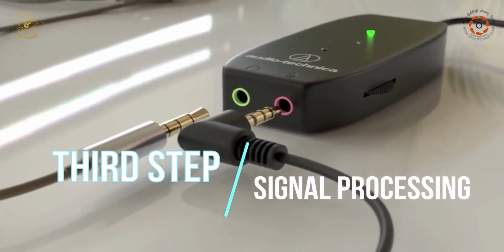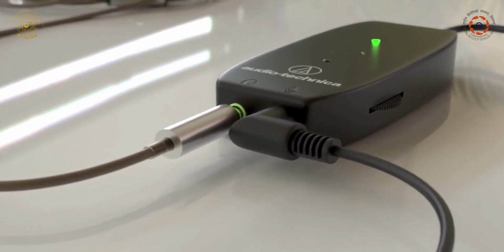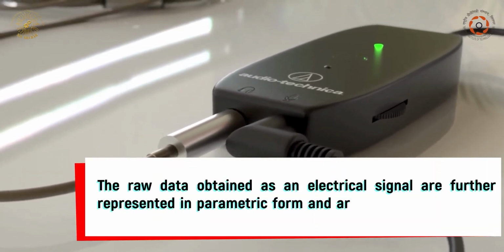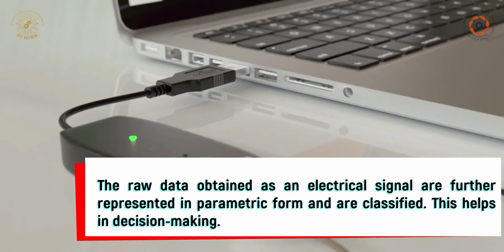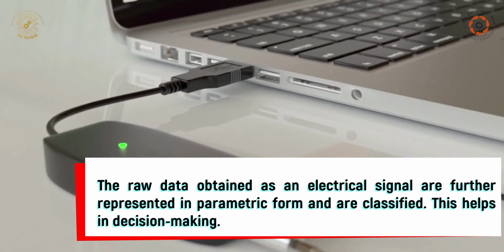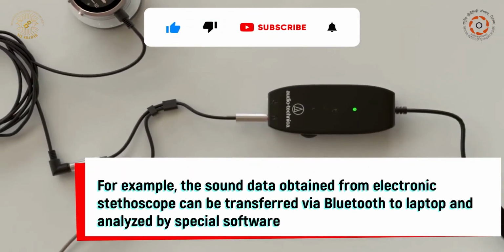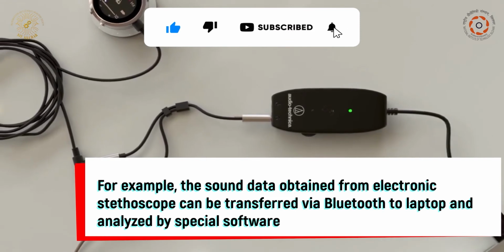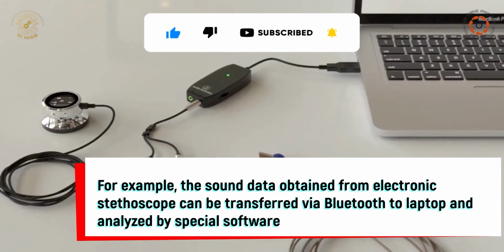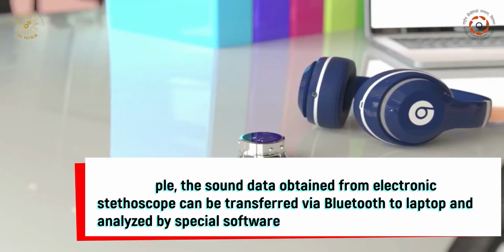The third step is the signal processing module. The raw data obtained as an electrical signal are further represented in parametric form and are classified. This helps in decision making. For example, the sound data obtained from the electronic stethoscope can be transferred via Bluetooth to a laptop and analyzed by special software.